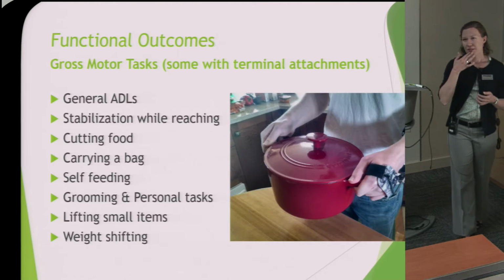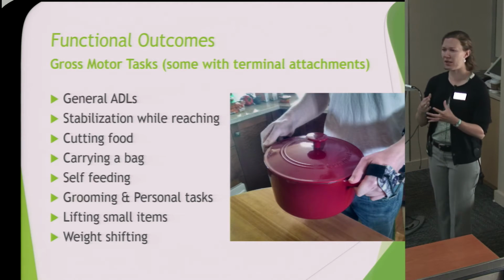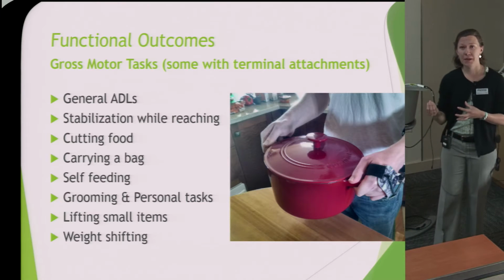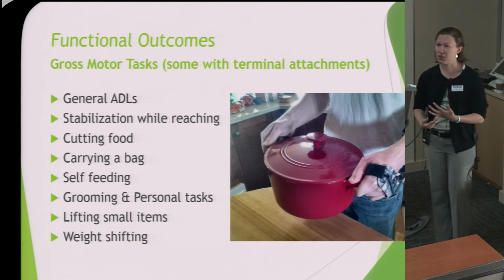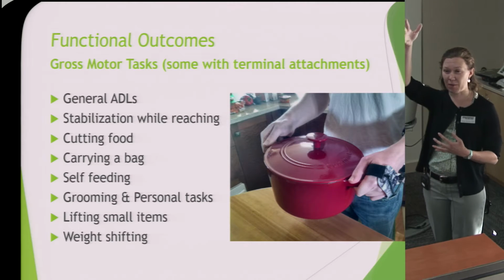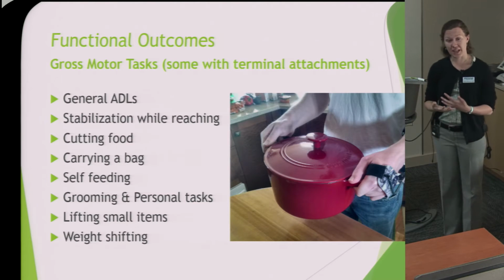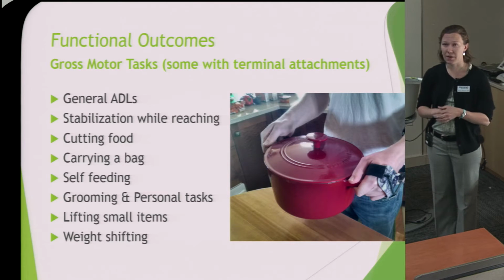So what are we talking about as far as outcomes? We are looking at gross motor tasks. So nobody is going to be writing, turning keys, picking up pennies, things of that nature, unless they already have that hand function. So what we're really looking at is, can you do your general ADLs? Can you feed yourself? Can you carry a bag while walking with your cane? If I'm going to reach in a counter above my head, can I put my arm down on the table? Those sorts of things. Some of these may have to be accomplished with those terminal attachments that we talked about, and then some patients will not need that. Some patients are able to do this without.